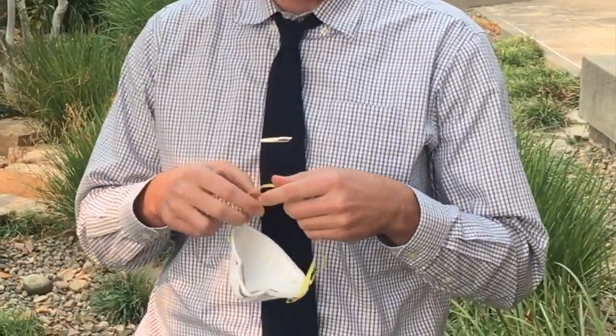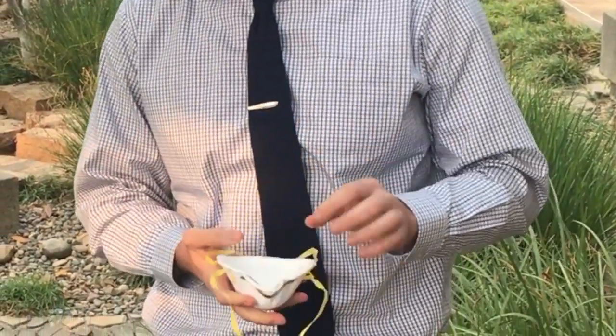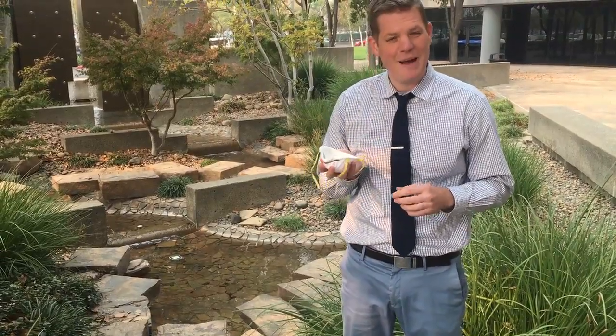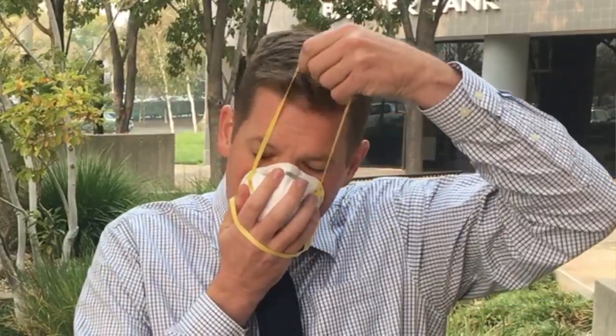The first thing they suggest is to stretch the rubber bands on the back. Then you're going to cup the respirator in your hand, put it over your mouth — I may sound a little muffled here. Then you're going to take one strap, put it on the top of your head, and the second strap can go behind.